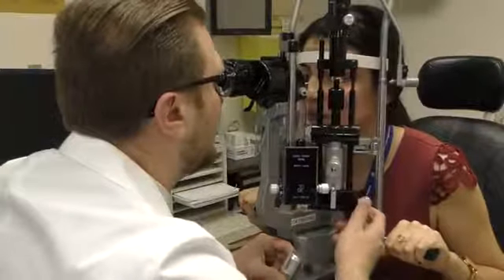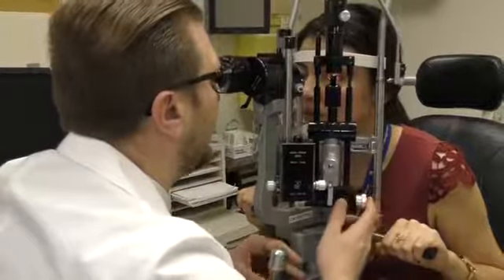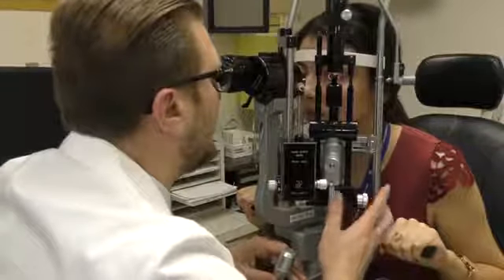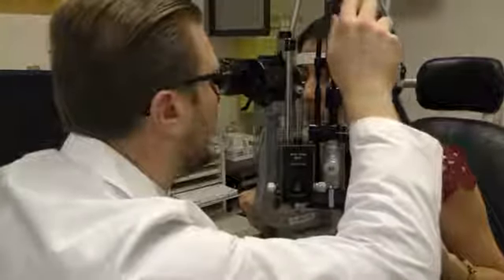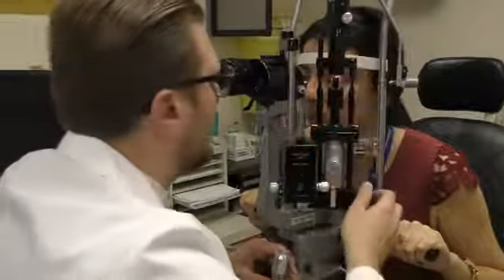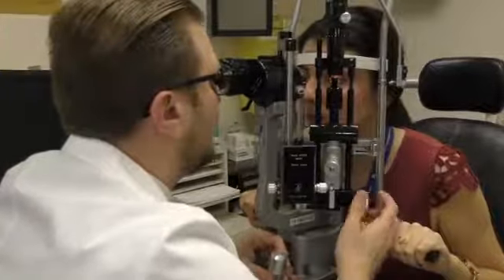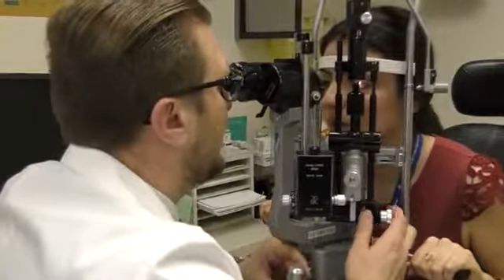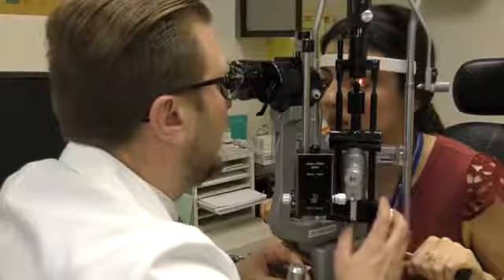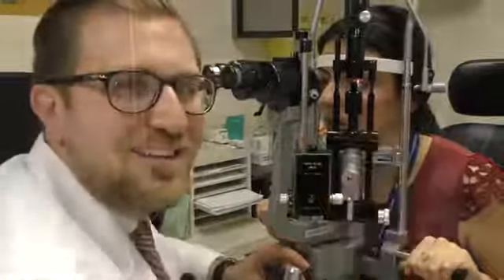It's amazing the view that you can see with this slit lamp. This is a real biomicroscope. It's a real microscope looking at the intricate ocular structures in real time. So you're looking at real pathology in real time, which is really cool. So now basically I have it positioned on her eye and I have a nice view of all the structures. So next we're going to move on to how to examine the eye from the outside in.